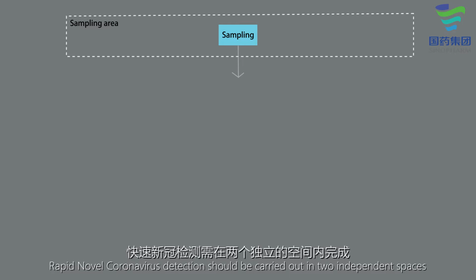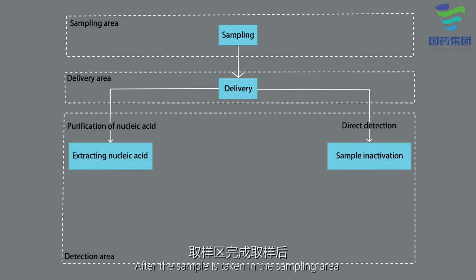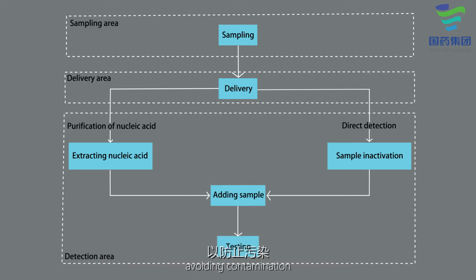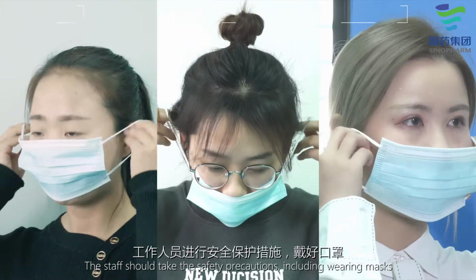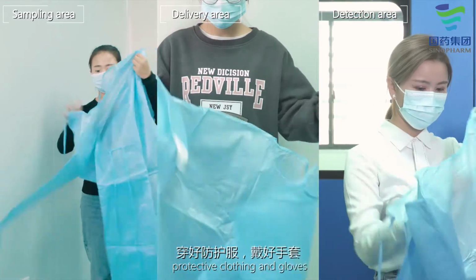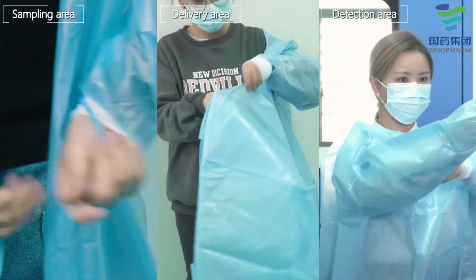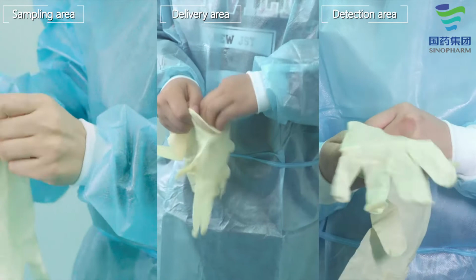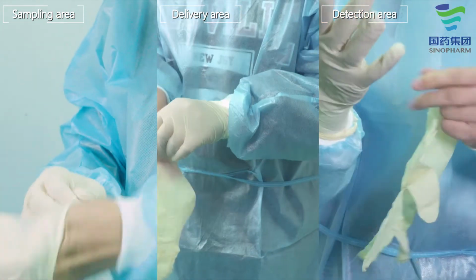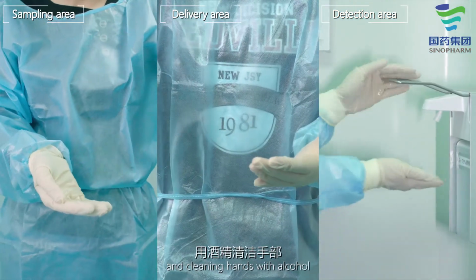Rapid novel coronavirus detection should be carried out in two independent spaces. After the sample is taken in the sampling area, it should be sent to the detection area by a specially assigned person for detection, avoiding contamination. The staff should take safety precautions, including wearing masks, protective clothing and gloves, and cleaning hands with alcohol.